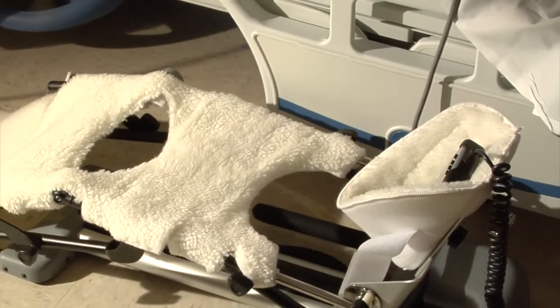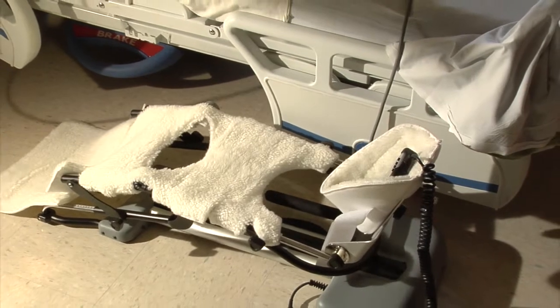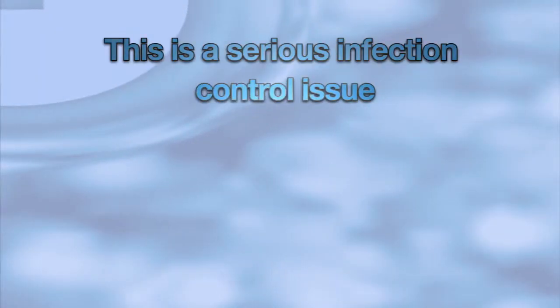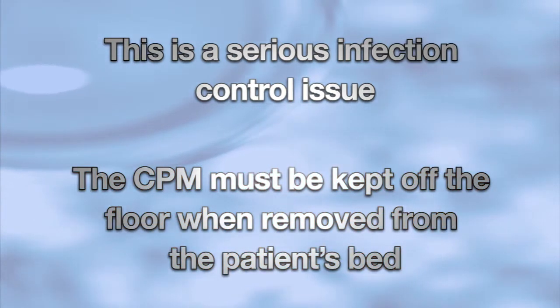Most patients will utilize their CPM machines during the day at intervals. During rest periods, the CPM machine is often removed from the bed. While under the bed is a great place for the cord, placing the actual CPM machine on the floor is not appropriate. This is a serious infection control issue. A CPM machine must be kept off the floor when removed from the patient's bed.